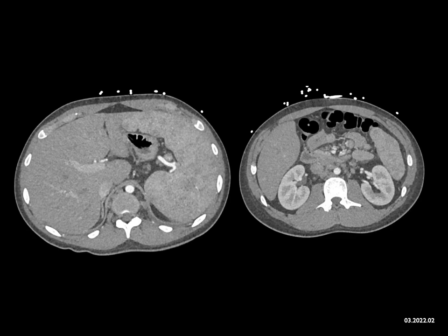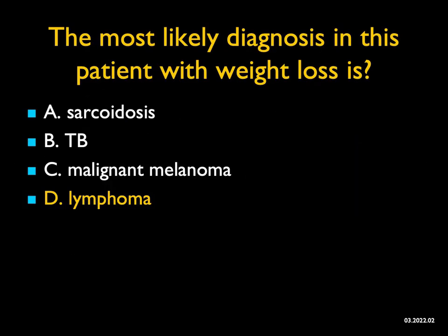TB can give you splenic lesions. The spleen may or may not be large, so I would consider that. Sarcoid can give you focal splenic lesions and an enlarged spleen, and most of the time you'll also see liver involvement as well. The subcrural nodes are worrying for something like malignancy. So again, lymphoma probably is the best bet. Big spleen, low-density infiltration — you've got to be thinking about lymphoma. Very nice example of the subcrural nodes, periaortic nodes, and peripancreatic nodes. The most likely diagnosis in this case will be lymphoma.